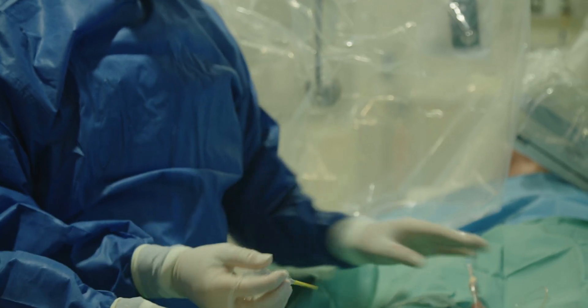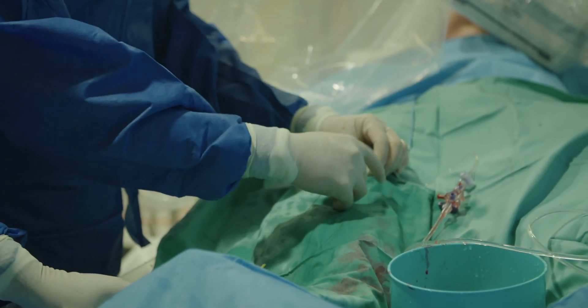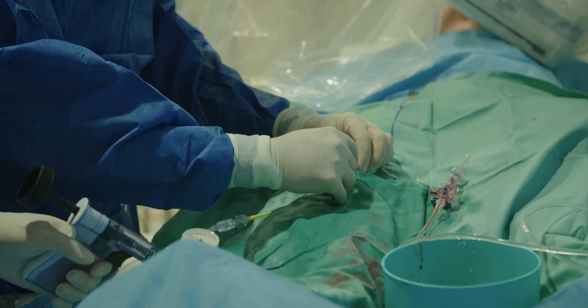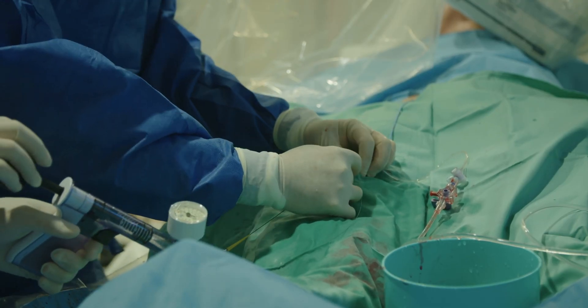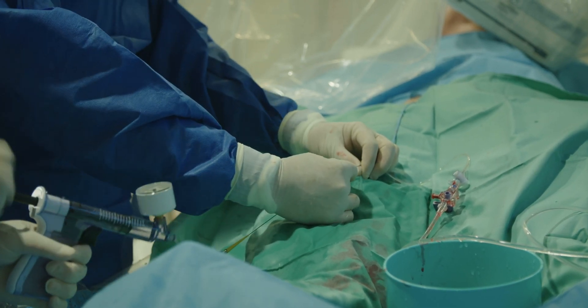We use a device called an indeflator. An indeflator is a very simple device that connects to the balloon and stent tip on one end. The balloon is placed inside the artery, and then we dilate by twisting this dial here. That has a measure which tells us the pressure that we are inflating the balloon at — in this one, it's what we call atmospheres.